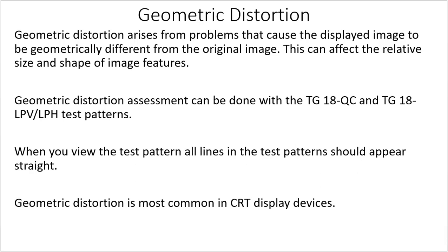So geometric distortion assessment can be done with TG18QC and TG18LPV-LPH test patterns. When you view the test pattern, all the lines in the test pattern should appear straight. And geometric distortion is most common in CRT display devices, and I don't think we have any more of those.